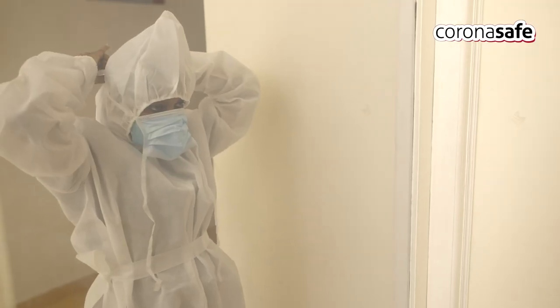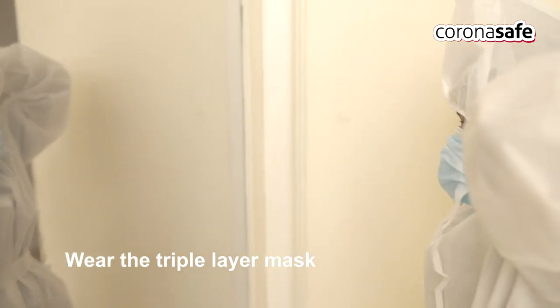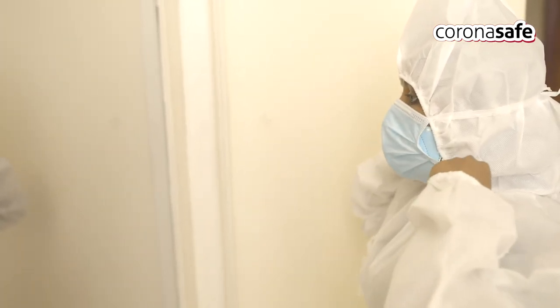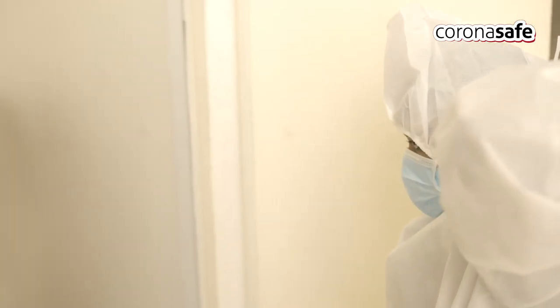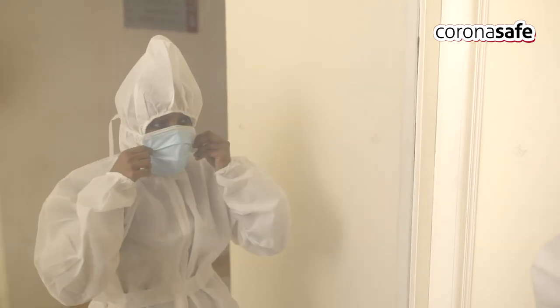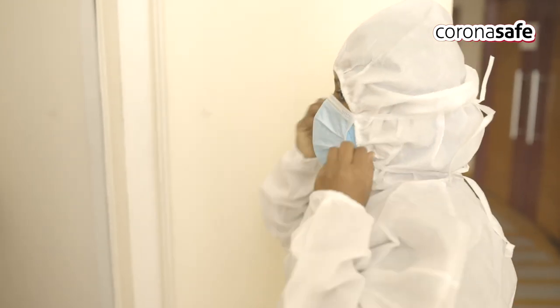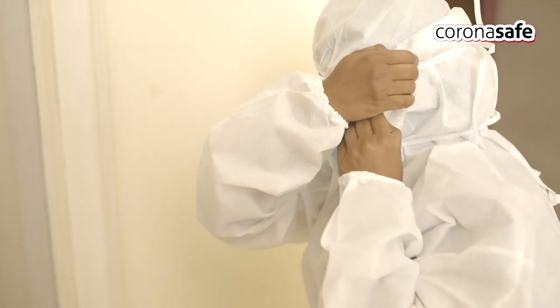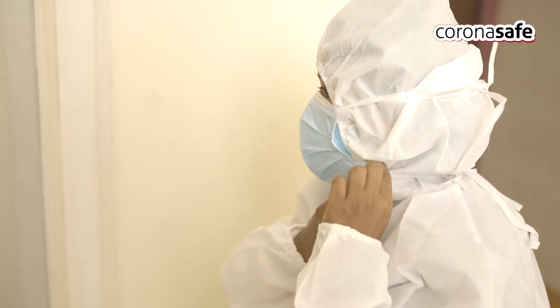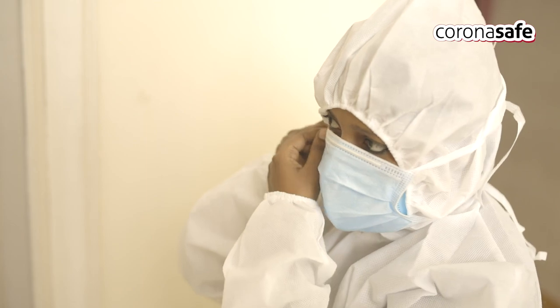Wear the triple layer mask over the N95 respirator. Reposition the hood to the eyebrows level. The excess portion of the hood should be pulled back and secured with the lace of the triple layer mask or with micro-pore.